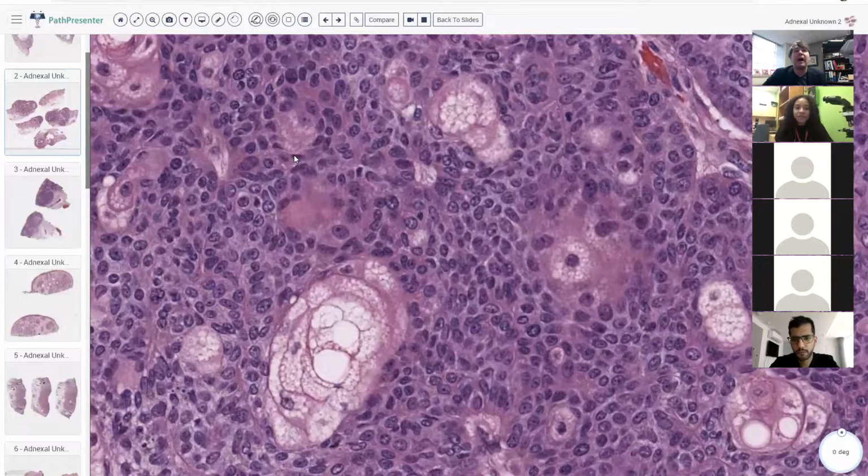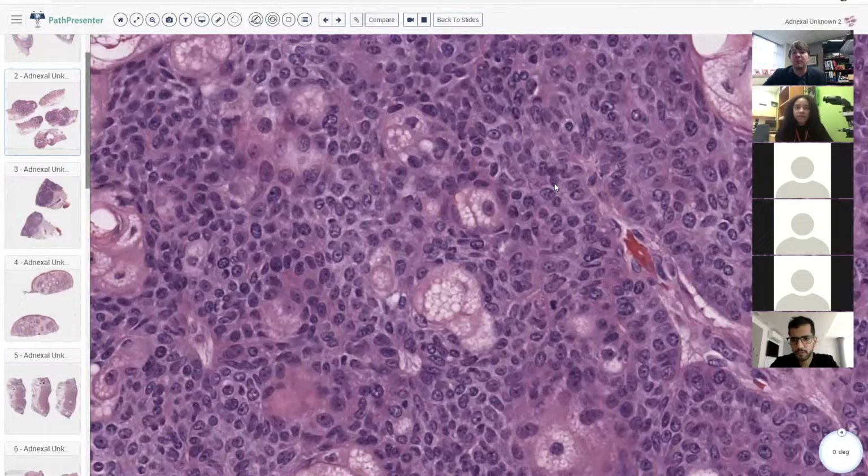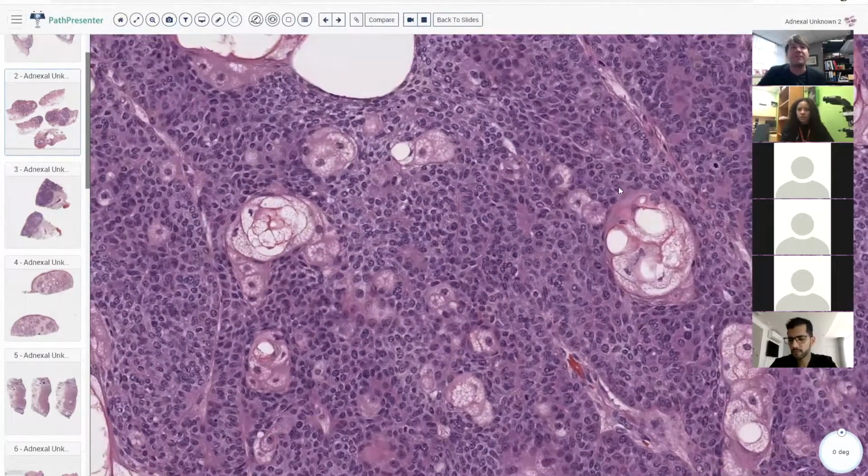So if you look around, I feel like I see mitoses in almost every sebaceous neoplasm, both benign and malignant. And the way I found that out is I was giving a course a few years ago, and I was trying to pull examples of benign sebaceous tumors, and I couldn't find any examples in my entire recut collection that didn't have mitotic activity. So either I've misdiagnosed a whole bunch of sebaceous carcinomas and called them benign, and I'm knocking on wood, hopefully that's not true, or it's just that mitoses are actually present in these cells. So I don't get too worked up about finding mitoses.